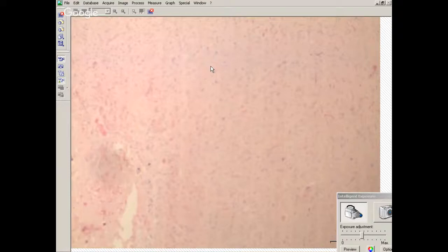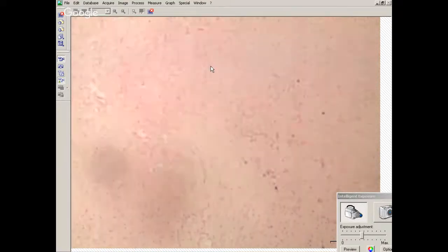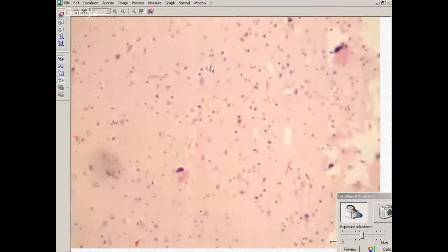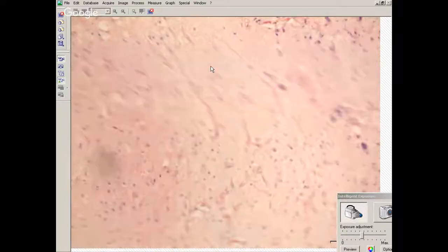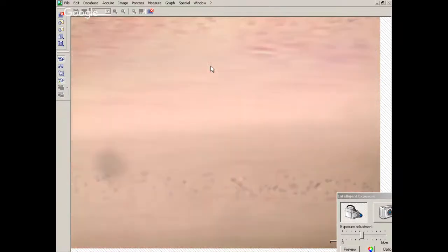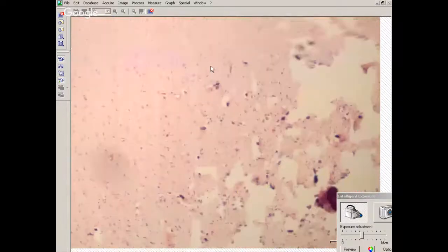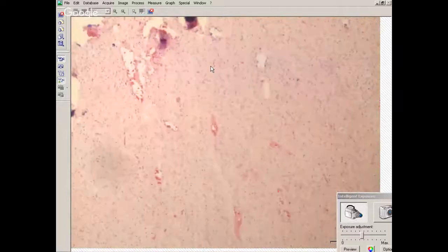Okay, so this is the next tumor. Now we've got brain, and there's an abnormal infiltrate, and there's calcifications. There are some blood vessels here, some thin capillary blood vessels here, and calcifications. This is not microcystic change, this is just calcifications that have fragmented the tissue.